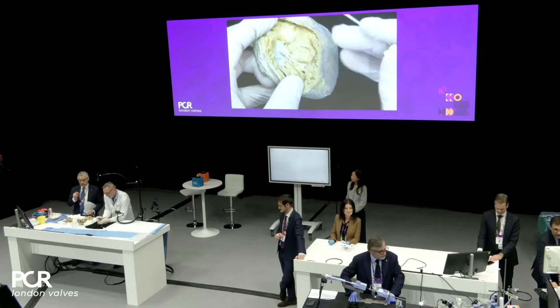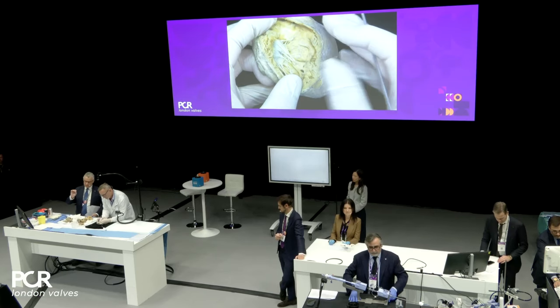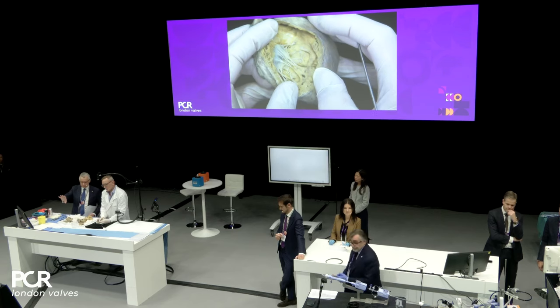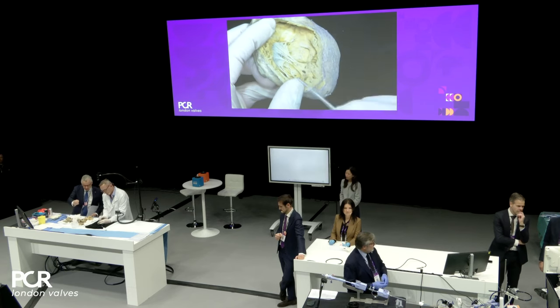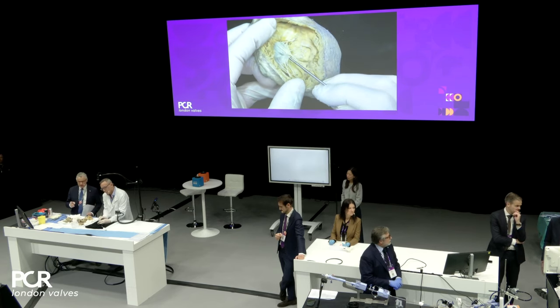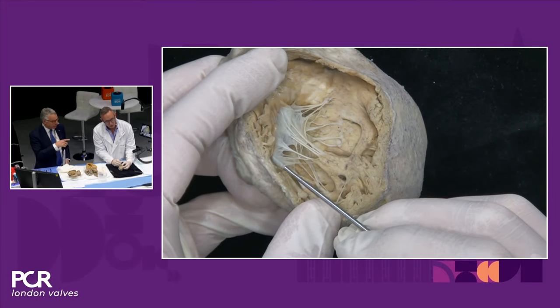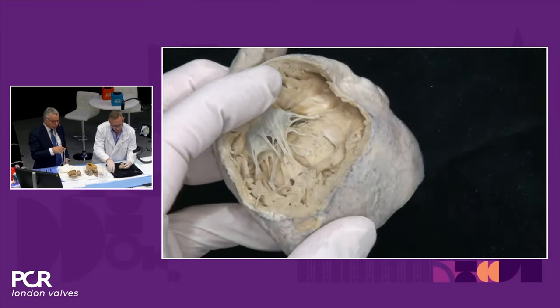One last question. In this image, it's very clear there are at least two nice chordal-free zones. One is anterior, one is in this posterior segment. Show us the chordal distribution of the septal. This is the problem we have. Show us how many chords are on the septal.